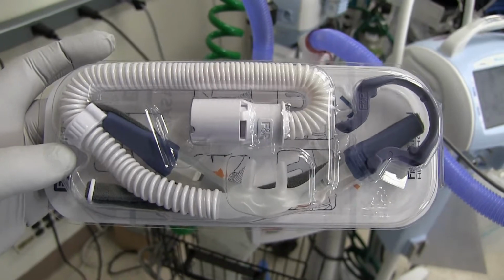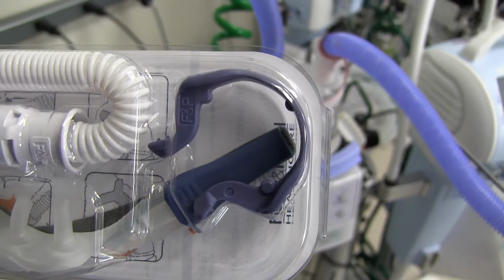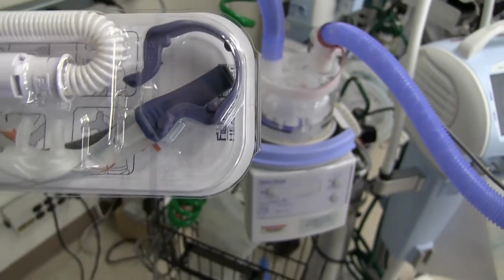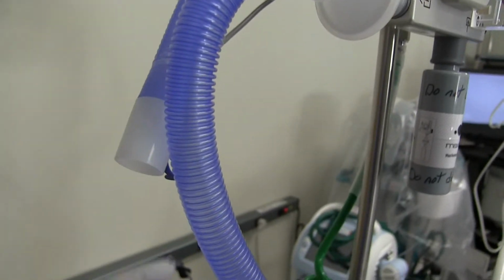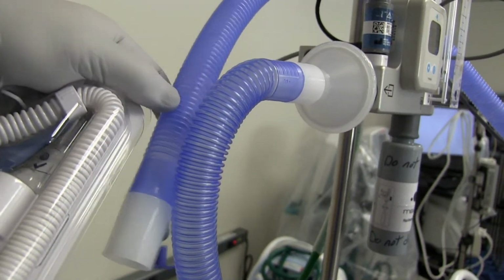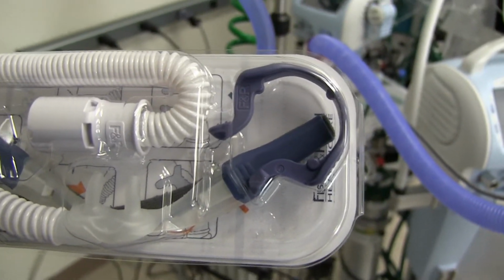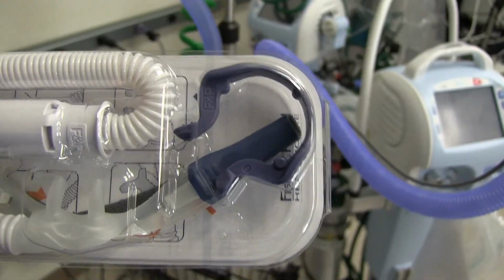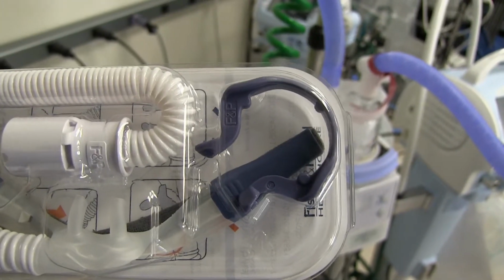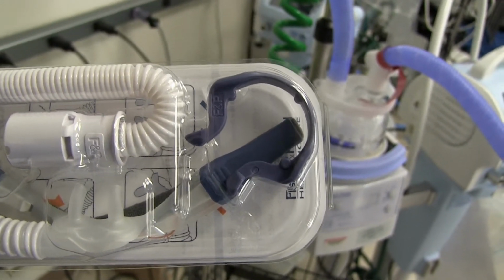It looks relatively the same as what we have in the lab, and if you notice this little blue piece right here, it kind of clamps together. You wrap that ring around your corrugated tubing circuit, on the long portion next to the patient, really close to where it connects to your high flow, and that blue clip will clip on to your patient's gown, so that your inspiratory limb is not dragging on their nose. It makes the patient more comfortable, and they're more able to tolerate the high flow nasal cannula.